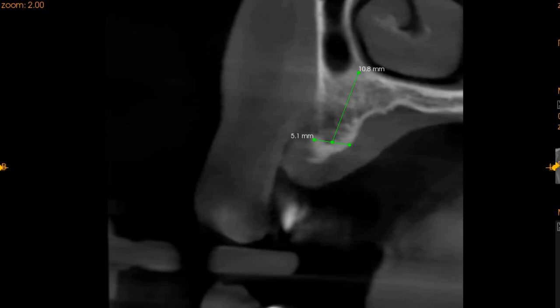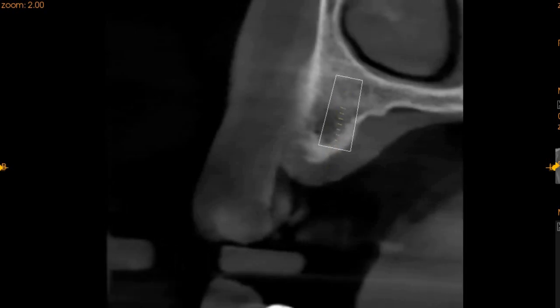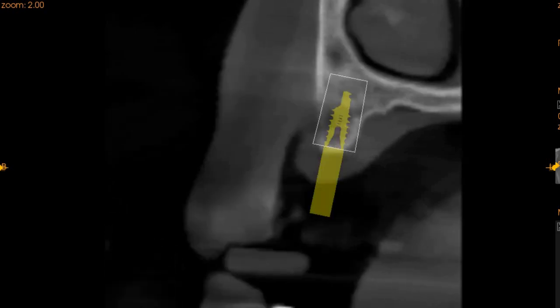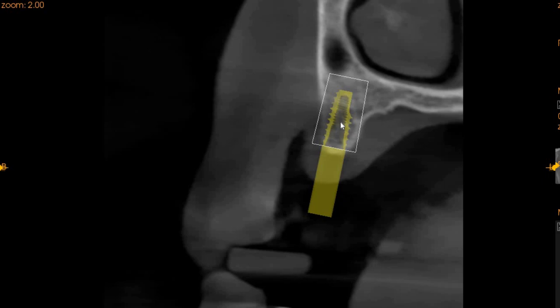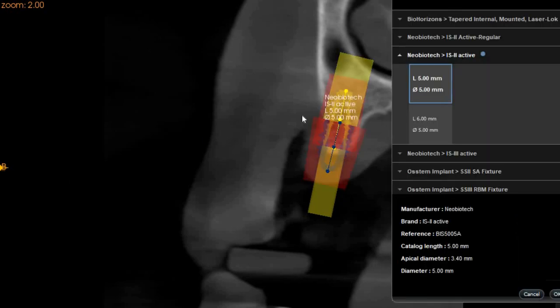The implant will have to be placed at a certain angle. Here, we can tell you how that angulation should be. This is the implant placed for this patient. It is slightly distally, but if it is placed correctly, we will have sufficient bone in the center.